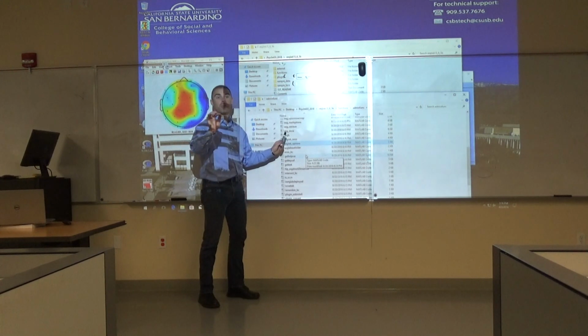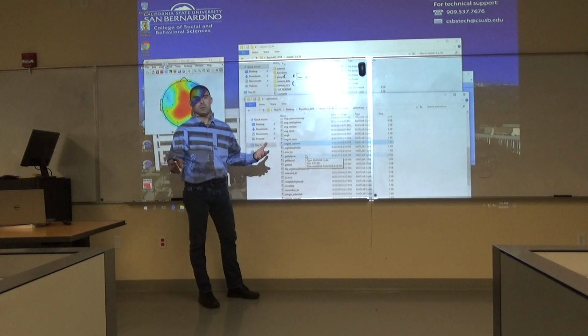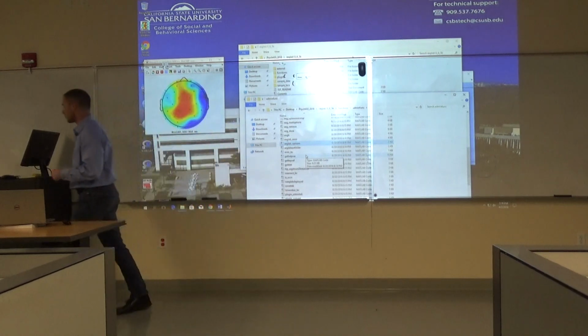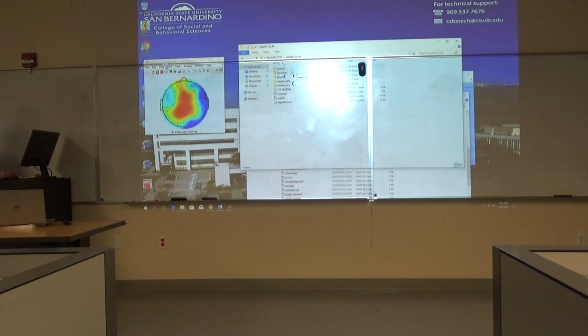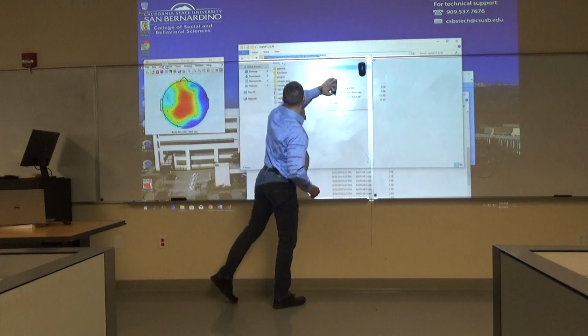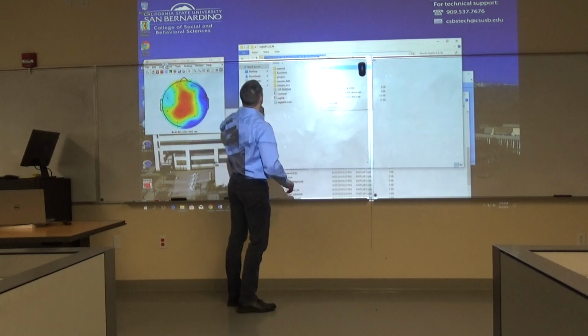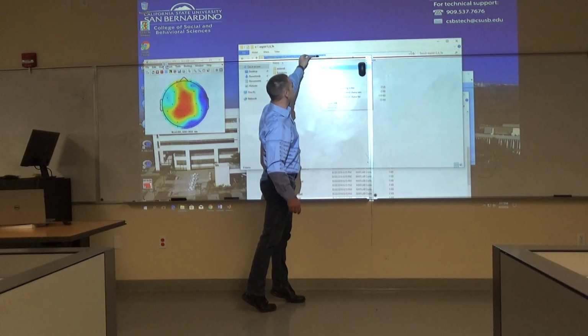So when you open that up, it'll probably ask you what program you want to use, Matlab, and then go to line 45. Okay, and when you're in line 45, you can right click like this. Up here, right click on that directory that goes straight through EEG lab and hit copy.